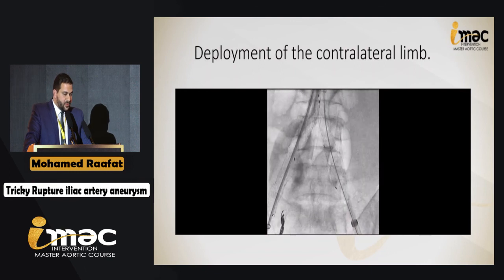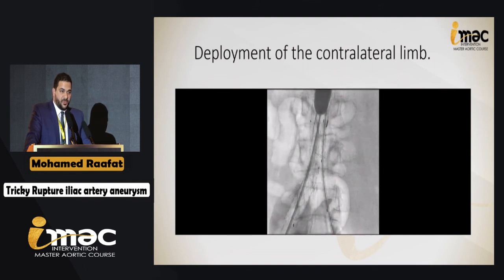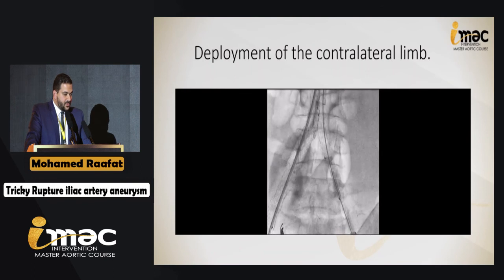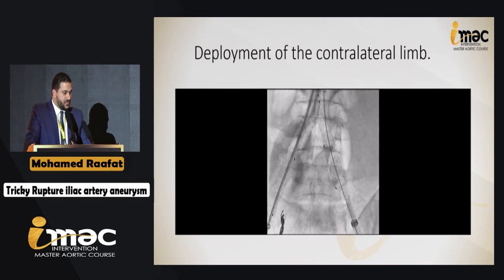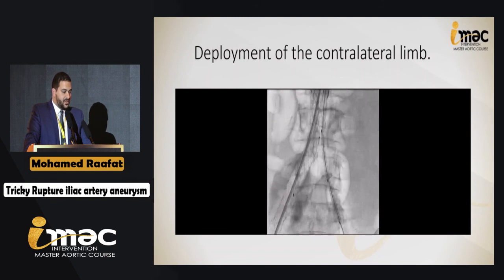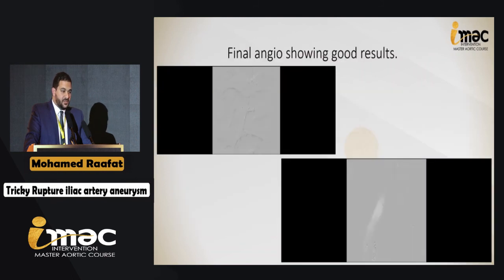Of course, post-deployment balloon was done to both sides. And this is the final angio showing us good results. The distal run showing us that the aneurysm was completely isolated and we had good results.